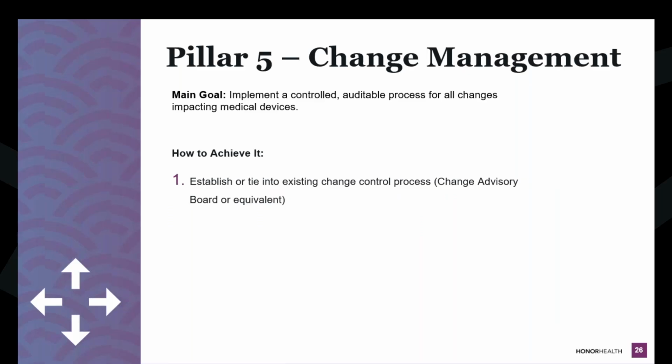We've never had that. Well, just to add one thing to that, we now sit on our IT's change advisory board, but when I first got on it, they said something like, we use the screen method to categorize whether a change went well. And I was like, is that an acronym? I've never heard of that before. And it literally is: if work orders start coming in after the change, that's the screen method. And I was like, that can't be possible. So we get to put our hand up now and say, if you don't know what's affected on the other end of this change, we're going to hold on it until you can let us know that it's going to at least be 80% good. And then we'll vote and move it forward. Luckily, our IT team has really partnered with HTM and given us that voice to halt things, and we have in the past. But obviously, there's room for improvement too.